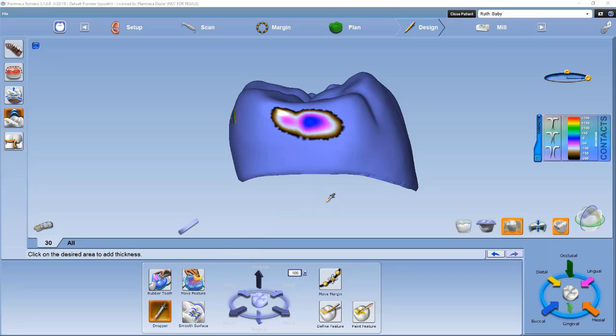Remember, if you're following the workflow sheet, you would normally use smooth surface to lighten the contacts. Here, we are trying to add to a contact. Let's apply it to the restoration.